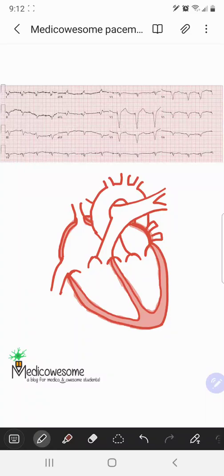Hi everyone. In this video we'll learn how to determine whether the patient has a BiV pacing or a standard ventricular pacing from the right ventricle based on the patient's EKG. The way you determine this is to think about where the leads are placed and what the complexes look like on the EKG.